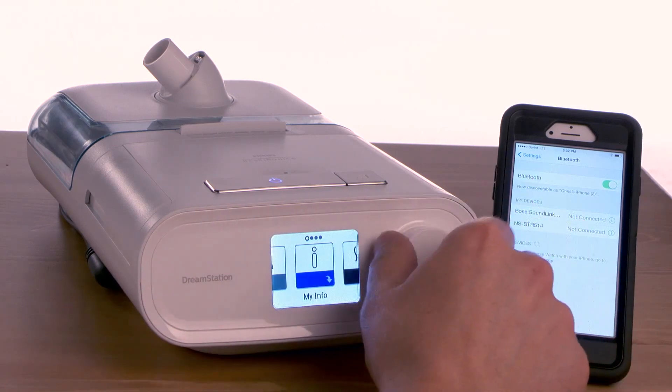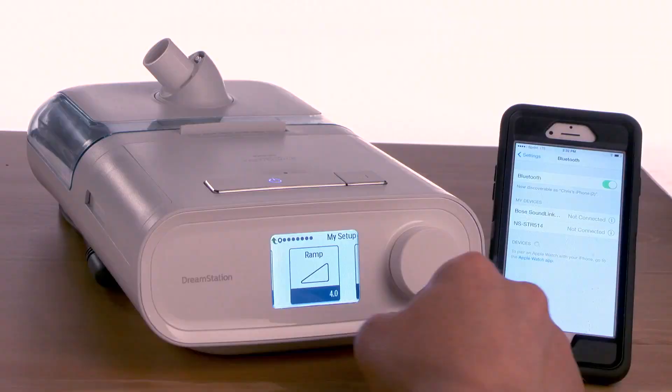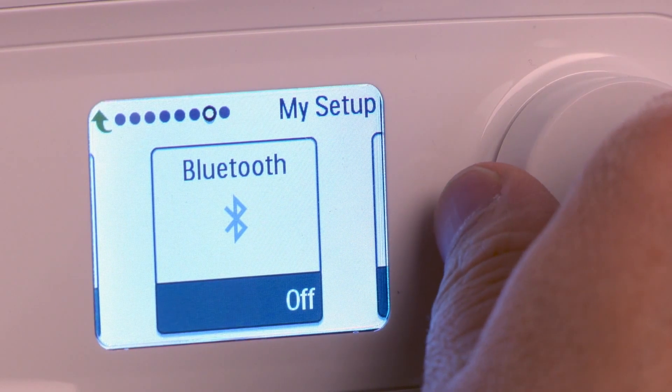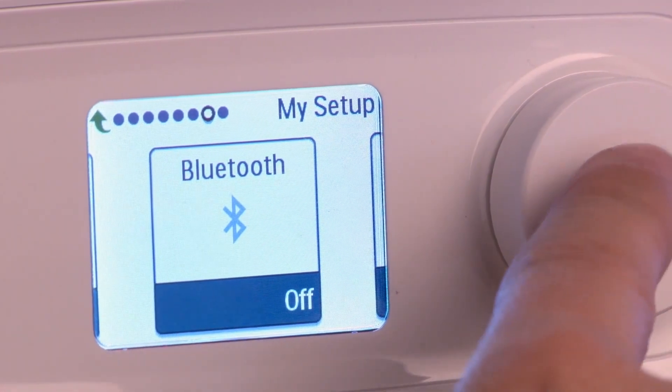On your DreamStation, select My Setup and turn the dial to Bluetooth. Once you get to Bluetooth, verify that it says on in the lower right-hand corner. If it is off, press and turn the control knob to on.